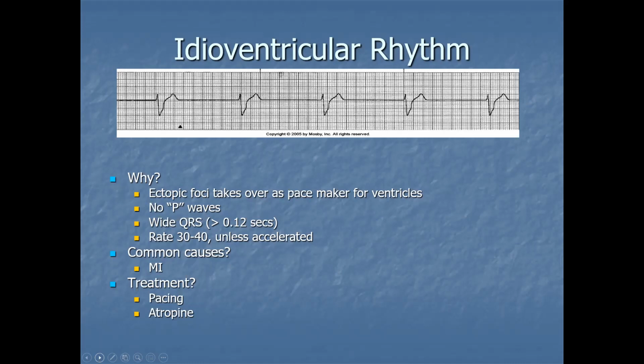And this does come up, and when you see this, this is typically a sick heart. It's not necessarily that the patient is coding, but it's a sick heart. There's probably a lot of pathology going on with this patient with regard to cardiomyopathy. They may have had multiple MIs. So there's a lot of scarring and dead tissue. So it's not just that they've lost pumping ability.